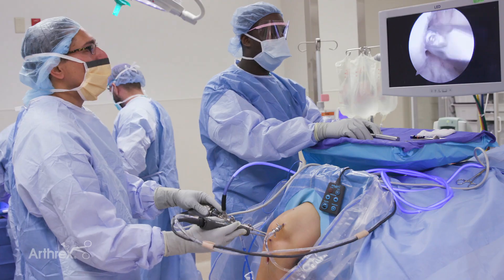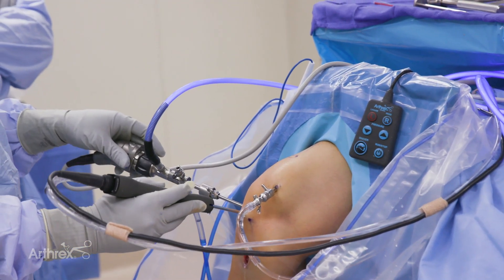What I found lacking in other fluid management systems was that oftentimes I would get wide fluctuations in the fluid inside the joint space. Too little fluid and I would get bleeding. Too much fluid, I get a lot of soft tissue swelling and extravasation.